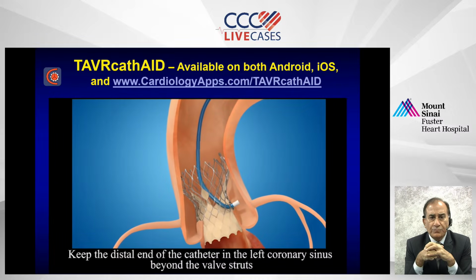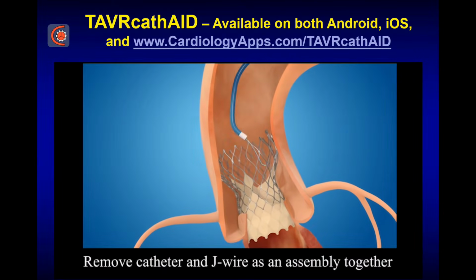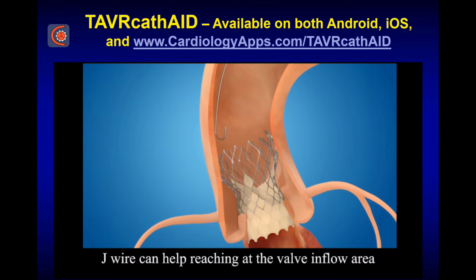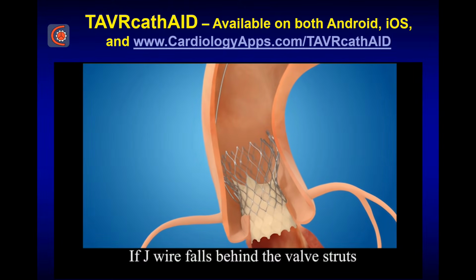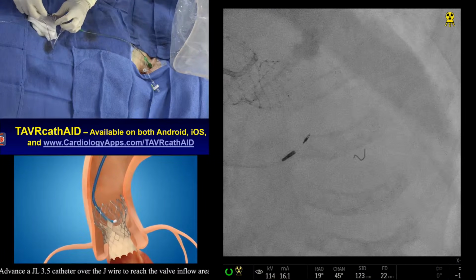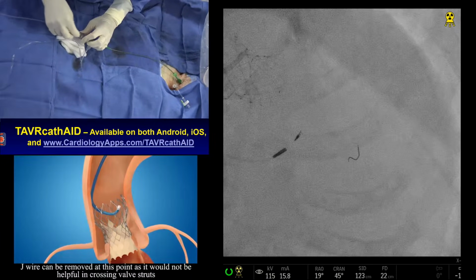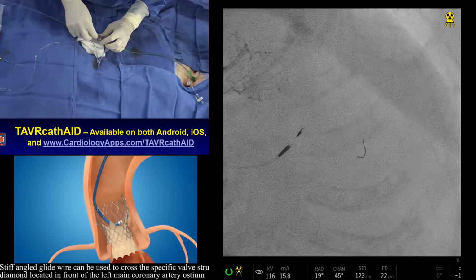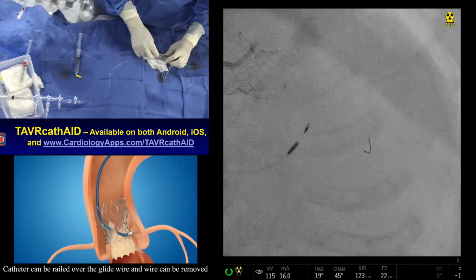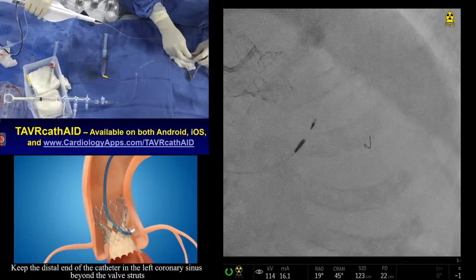I cannot say for sure because we don't have experience with that. Any time post-TAVR patients come, most of the time we try to go by the femoral approach. But there was one patient on whom I did at least 7-8 PCIs, all with the left radial. In that particular case the patient had a LIMA also. For 5 years post, we did 6-7 PCIs through the left radial. So in rare cases we do radial, but I have no doubt that a radial expert will say this is a straightforward case, go from the left radial. Nothing wrong in that.